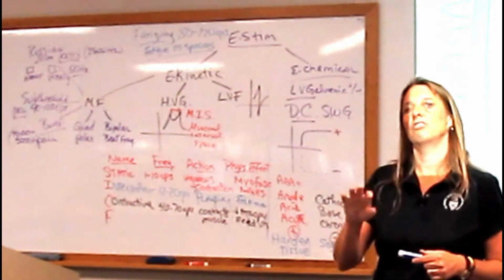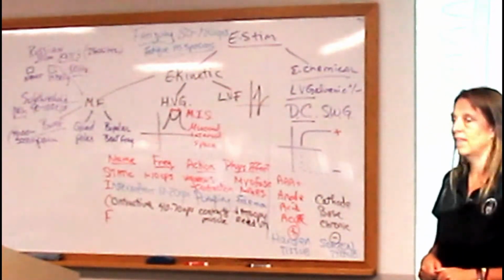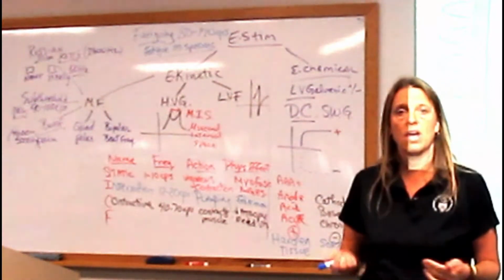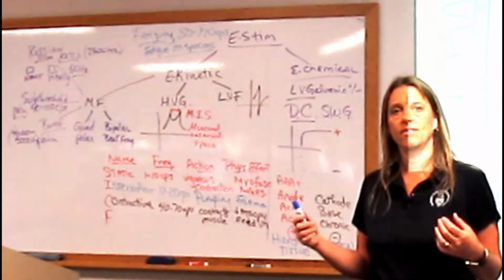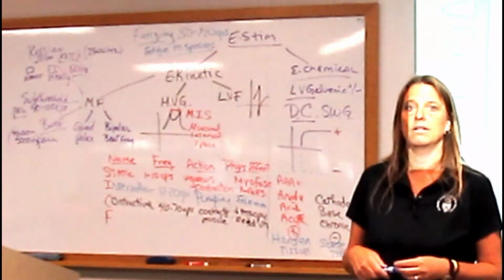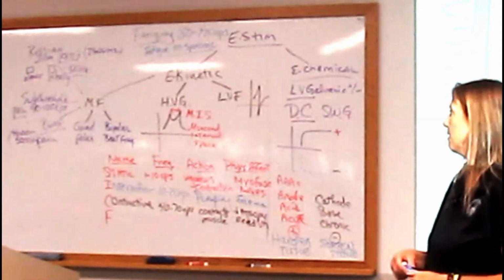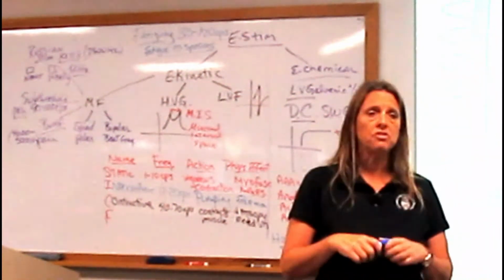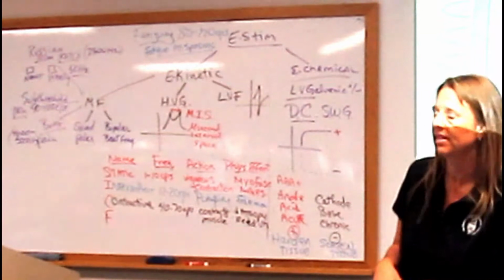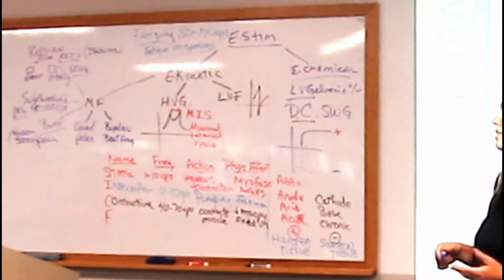little bit of stimulation there helps pump out some of the edema that's going on in there. And then the contractive you may use if you're helping people regain strength after having been immobilized due to casting or due to injury, due to muscle splinting and unable to move, bed rest, that kind of thing. There, of course, are contraindications to all of this. That's not part of this lecture. This is just to show you the different frequencies and the 3 different ways that we can do these frequencies.